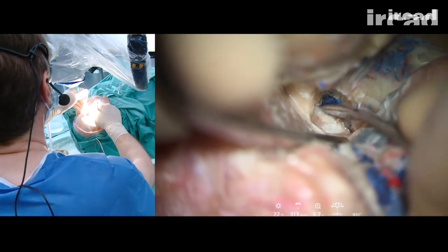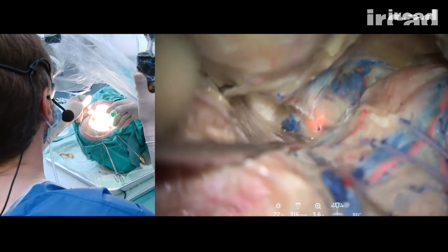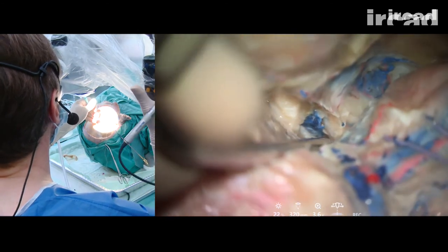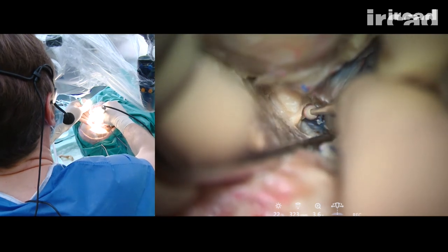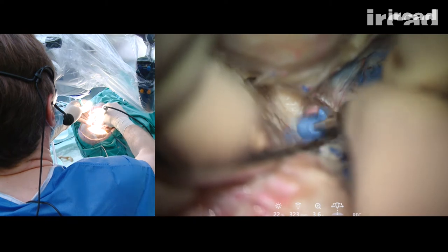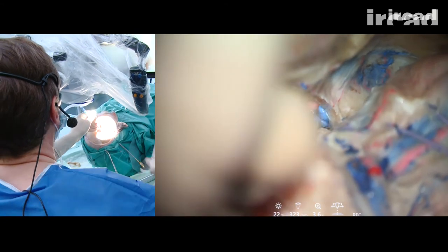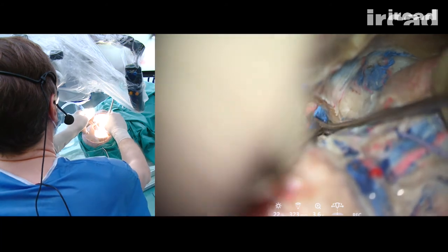So here is probably the venous plexuses around the carotid artery. And with a little bit more, I took the venous plexuses in my drill, and here is the carotid artery.